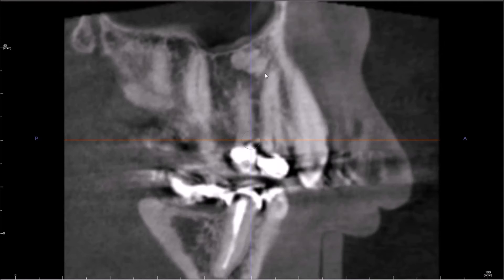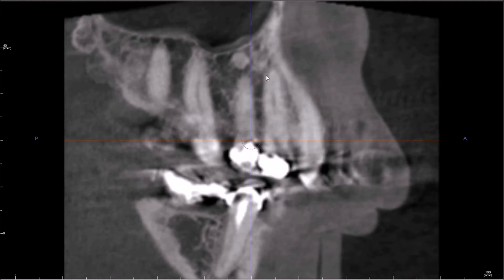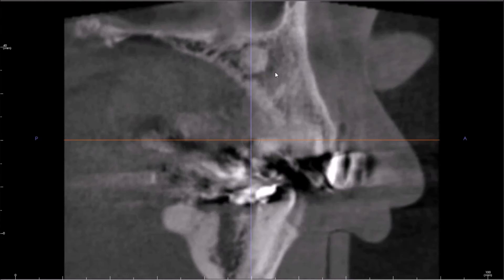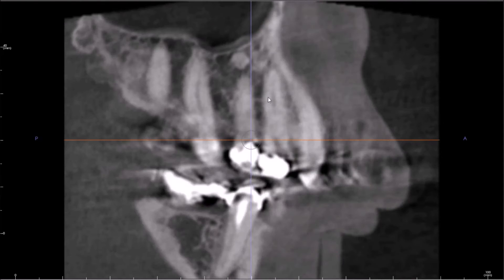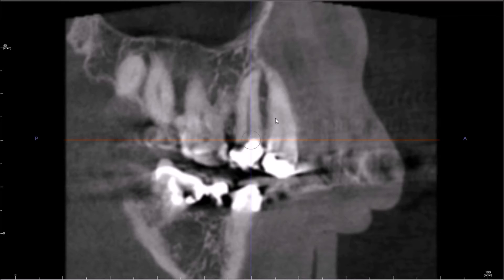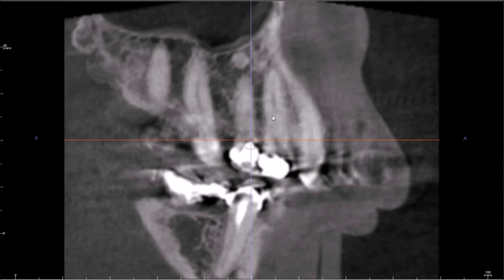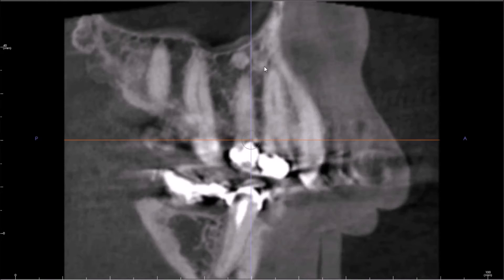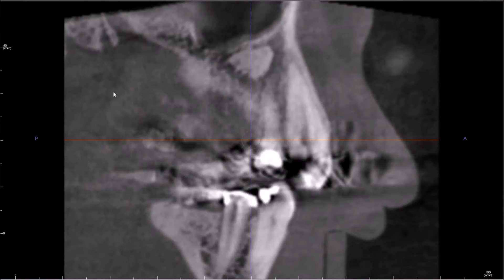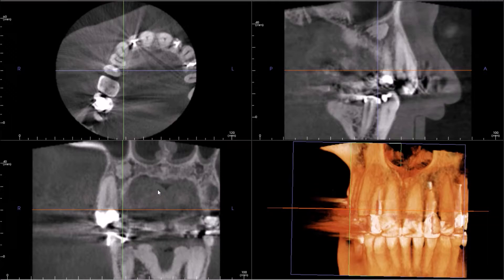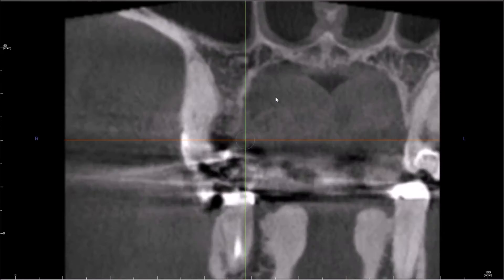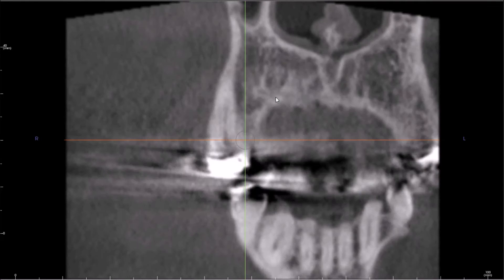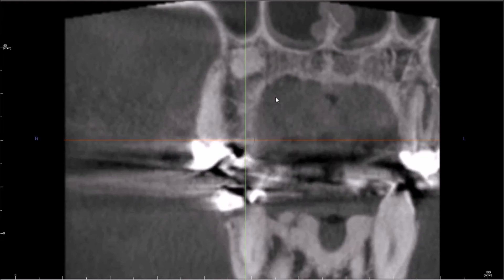An important thing also is that it's not communicating with the roots of these teeth. So one thing you might suspect is condensing osteitis — if you thought one of these teeth could be necrotic and causing condensing osteitis here — but I don't think that's the case. If you've had experience seeing these, you should know by now what it likely is.